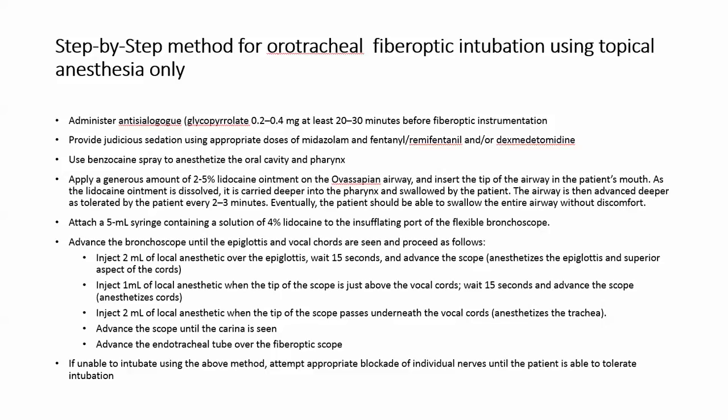As the lidocaine ointment dissolves, it is carried deeper into the pharynx and swallowed by the patient. The airway is then subsequently advanced deeper as tolerated by the patient every 2 to 3 minutes. Eventually, the patient should be able to swallow the entire airway without any discomfort.